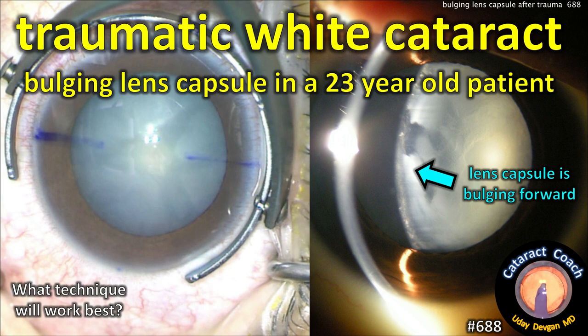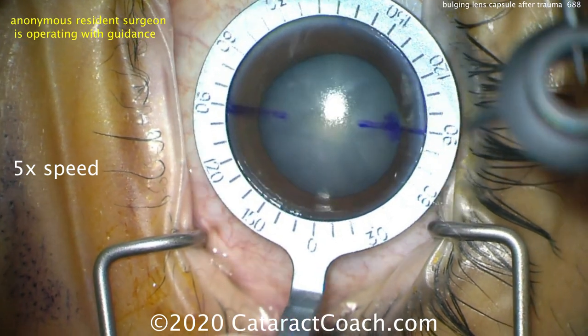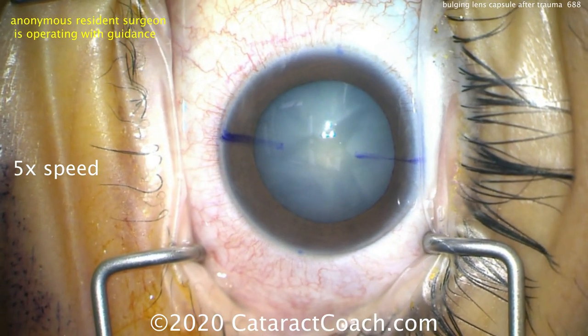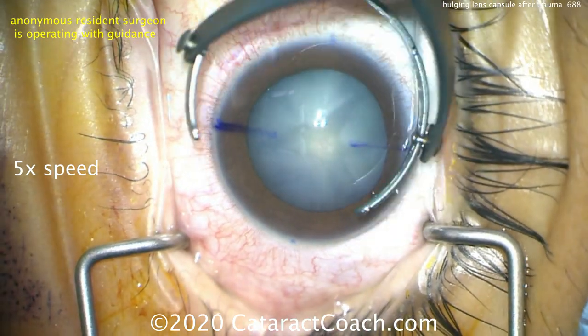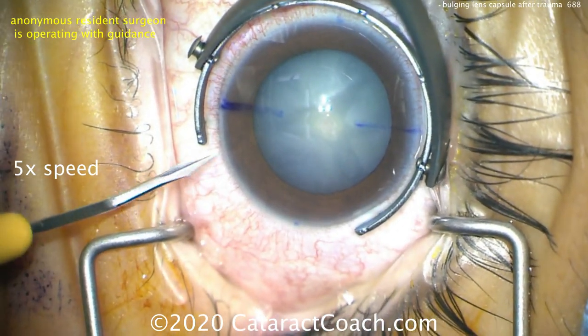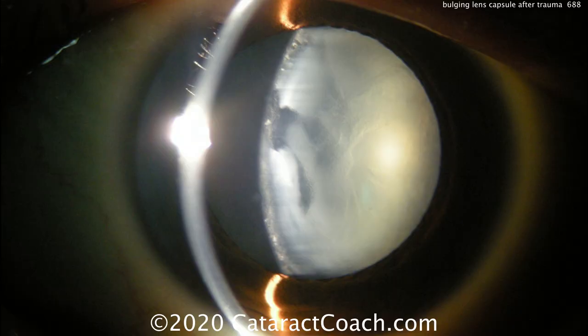Traumatic white cataract and a bulging lens capsule in a 23-year-old patient — what technique is going to be best? This is an intumescent white cataract, so the capsular bag is fluid-filled and it's bulging forwards. It's hard to see that in this microscope view, but at the slit lamp you can see that the central lens capsule is arched and bulging forward. This tells us the capsular bag is highly pressurized.